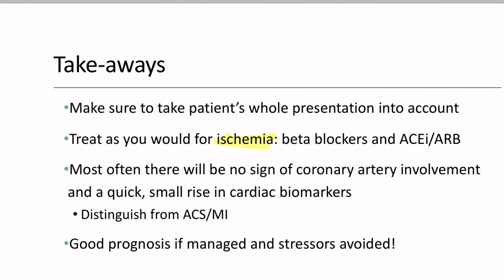Most often there will be no sign of coronary artery involvement, so this is kind of one way to distinguish it, as well as a quick small rise in cardiac biomarkers as opposed to a longer, higher rise in things such as an MI or acute coronary syndrome.